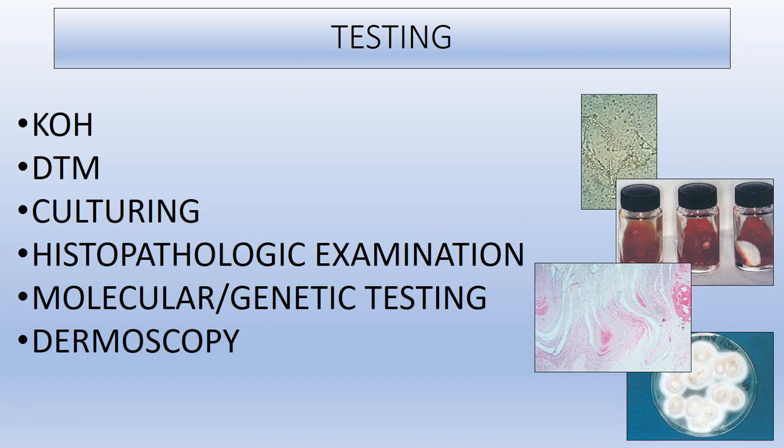Direct microscopy, or KOH, is easily done in the office setting. It no longer requires heating with DMSO. However, the majority of podiatrists generally do not perform a direct microscopy in the office. DTM testing was quite popular for some years. Dermatophyte test media testing, unfortunately, now requires a laboratory certification burden, and most podiatrists, I think, have chosen to abandon DTM because of the standards that are required for the office in terms of laboratory standards.